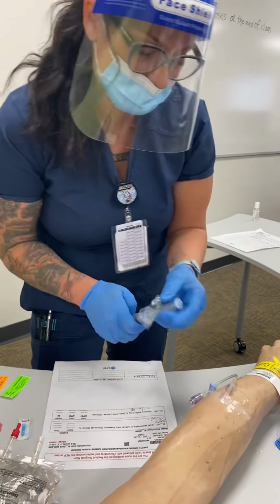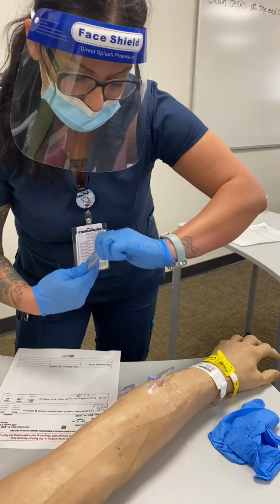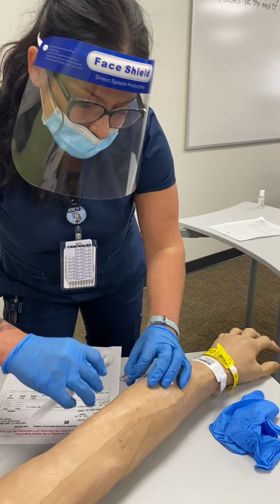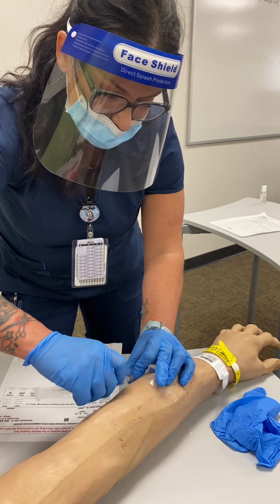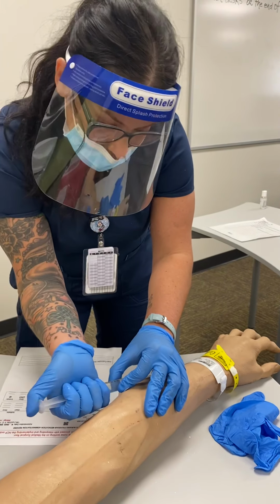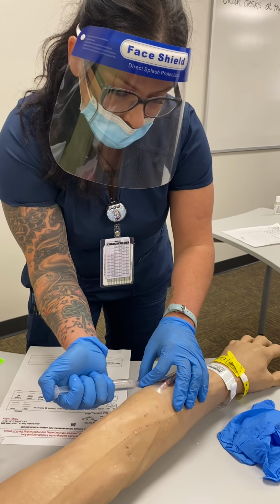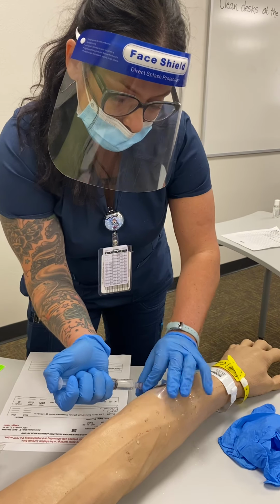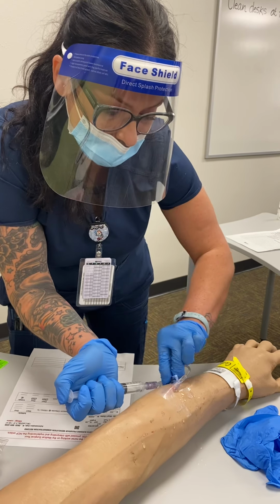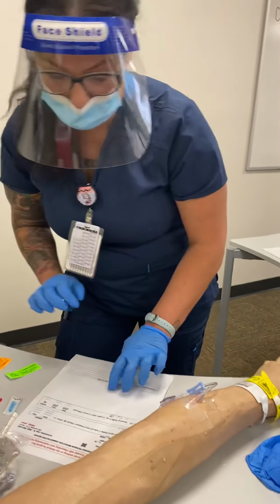Okay, you're going to get your second flush. And I dropped that, so I'm going to clean it again, make sure it's dry. Attach. Now there's still medication in this tube, in the lumen, so you want to just push slow for the first like 1/2 ml and then just get it in there. And for that, I'm going to lock and then release. Okay, so patient's got her morphine.